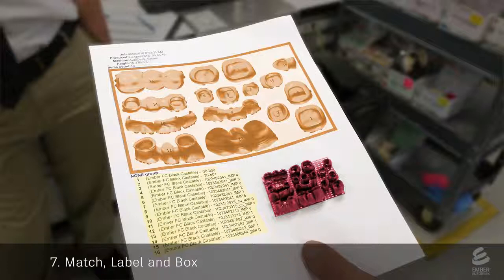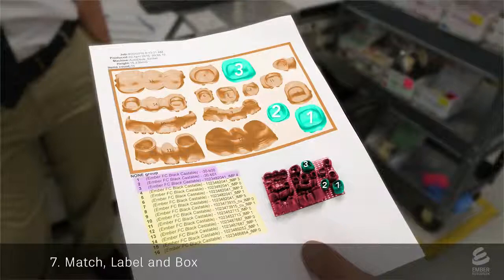For example, the image labels crowns number 1, 2, and 3, which match these crowns on the print and these cases for a patient.